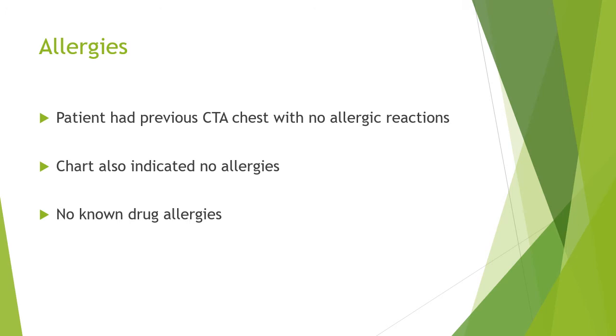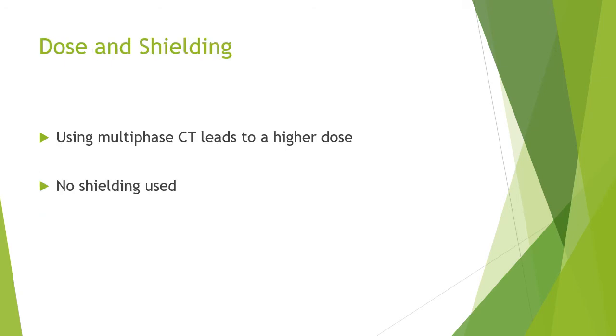Before the exam started, we determined that the patient had no contrast allergies. When the patient went through their first CTA chest exam, there were no issues with the contrast given. The patient also had no known drug allergies as well, so should the patient suddenly develop an adverse reaction, we wouldn't be restricted in what therapeutic drugs we could use.